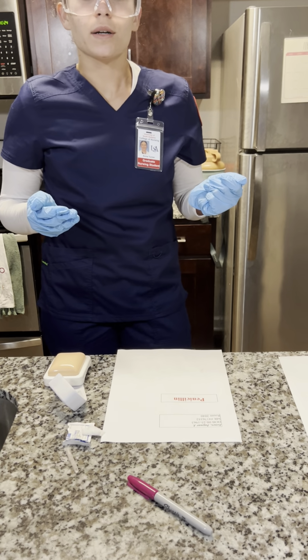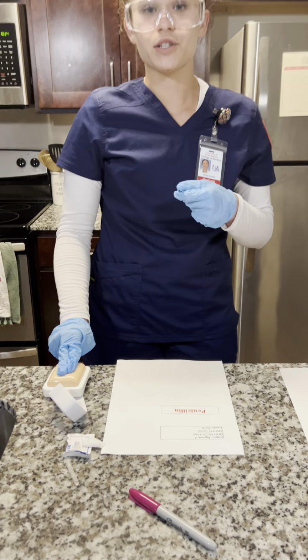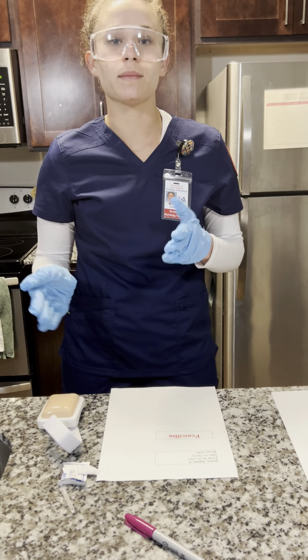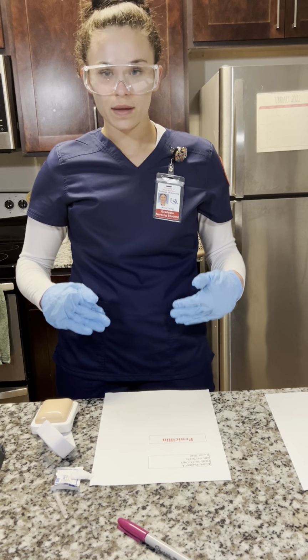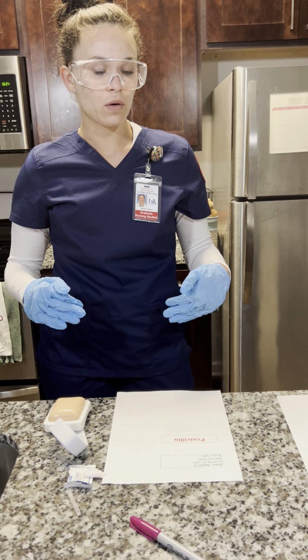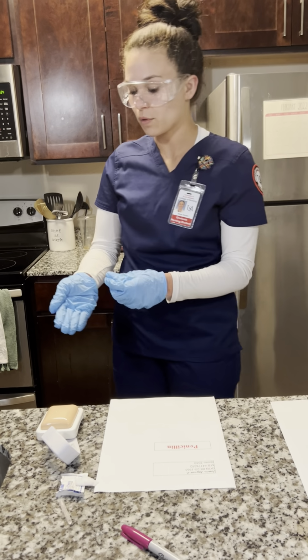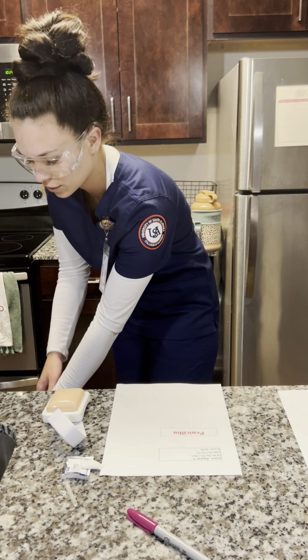And then from here, I'm also going to apply pressure after giving the injection, just slight pressure. And then from there, I'm going to assist the patient to make them more comfortable, raise the side rail, lower the bed back down, and then observe the patient for any adverse reactions immediately. I'm going to take my gloves off, facing the trash can down.